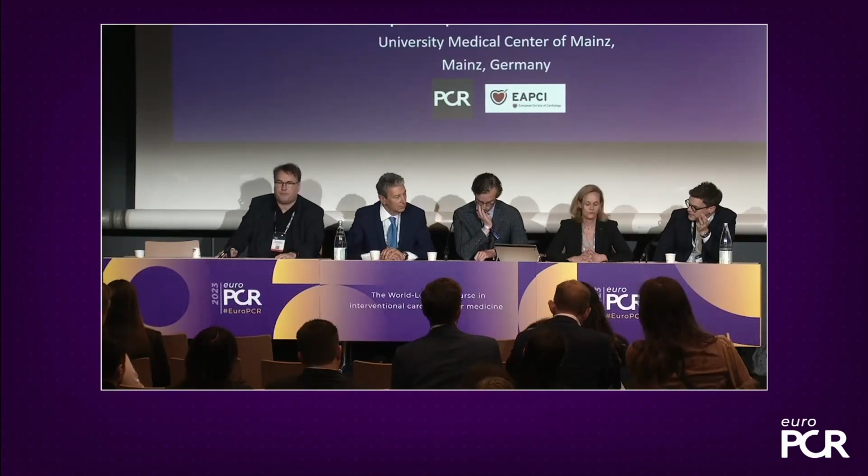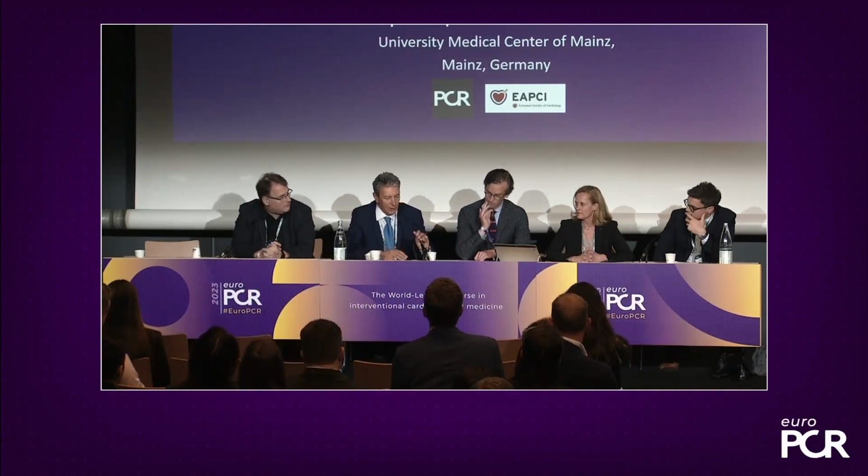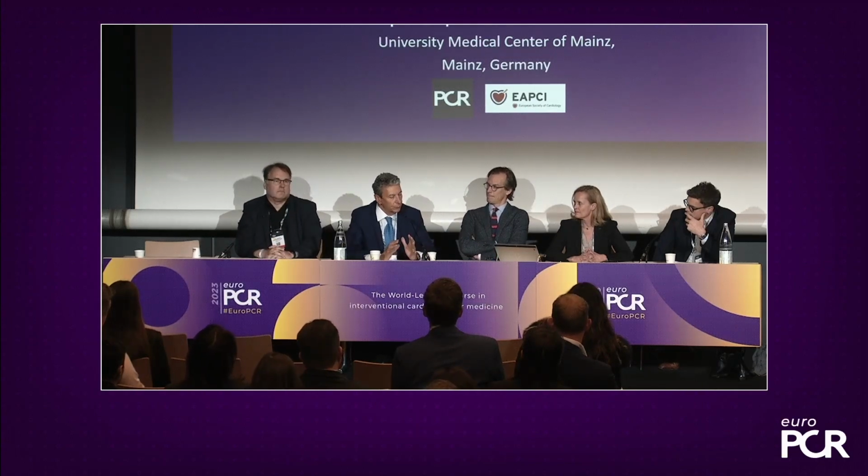Maybe, Sergio, which kind of indication or procedure would you feel comfortable doing with ICE only? I think we have to change the point of view, because it's completely different to move from the TOE to ICE, because the TOE is fixed in the esophagus, so you can go into the stomach. The point of view of the ICE is completely different, because you can advance the device on the basis of the target that you want to image. For example, for the tricuspid valve, where the TOE has some limitation due to the position of the valve and the distance from the probe, you can overcome all these limitations by advancing the probe in the right atrium. You have the mitral or tricuspid valve in front of you. There is no other structure in the middle, so the quality of the imaging is very, very high.